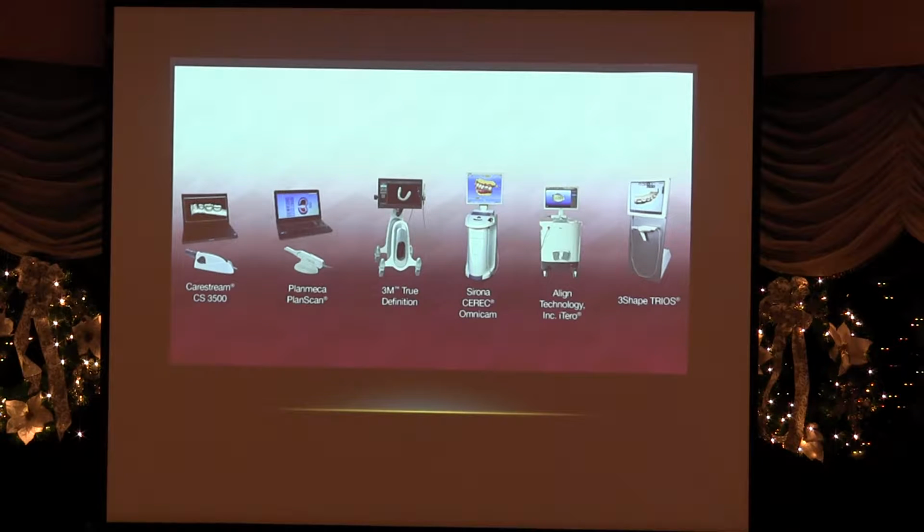But then with scanning systems like 3M True Definition, Medit, and Planmeca, you have to pull the STL file from their scan to upload it to our website portal, or attach it to an email and send it, so we can use them as your intraoral scans.